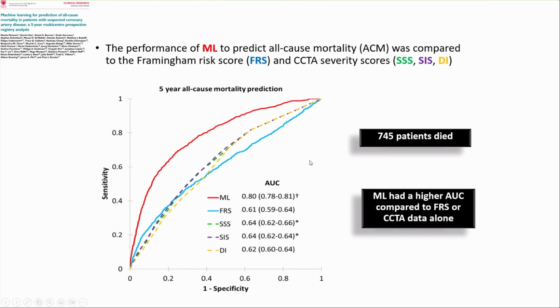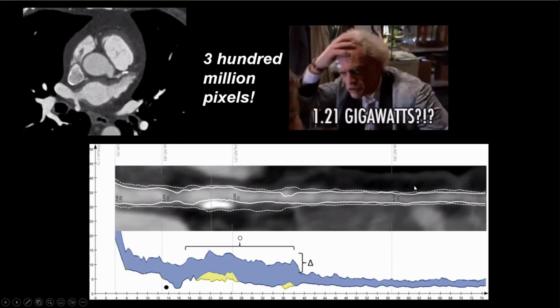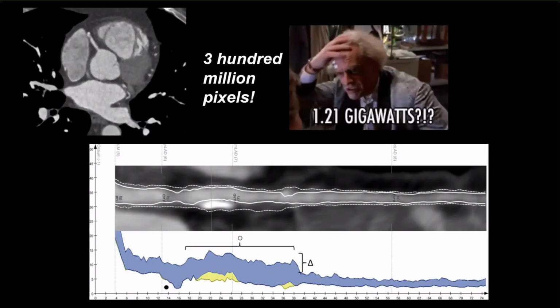So you can see here how machine learning is being used to integrate all of that data, both imaging and clinical factors, in a capacity well beyond human cognition, to be able to predict a patient's individual personalized risk of mortality. But look, our CT images are getting better and better, and Dr. Khalique will come on to that with photon imaging.